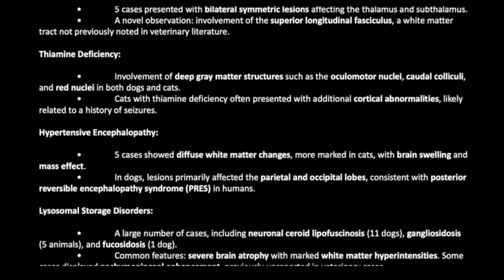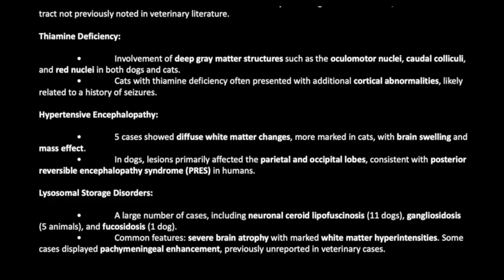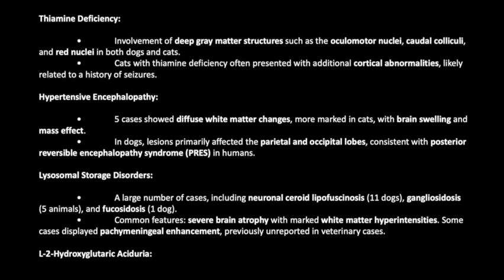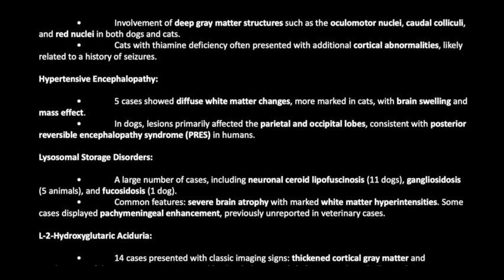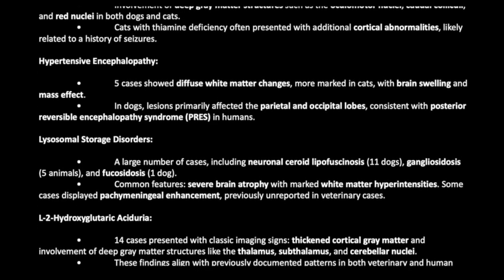Lysosomal storage disorders: a large number of cases, including neuronal ceroid lipofuscinosis, 11 dogs, gangliosidosis, 5 animals, and fucosidosis, 1 dog. Common features: severe brain atrophy with marked white matter hyperintensities. Some cases displayed pachymeningeal enhancement, previously unreported in veterinary cases.